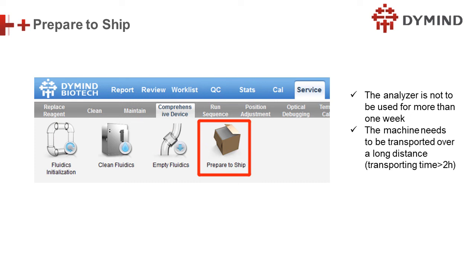Prepare to ship. When should we do the prepare to ship? First, if the analyzer is not to be used for more than 1 week, we have to do the prepare to ship. Second, if the machine needs to be transported over a long distance, transporting hours over 2 hours, we also have to do the prepare to ship.